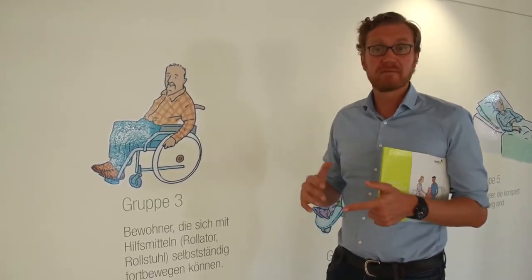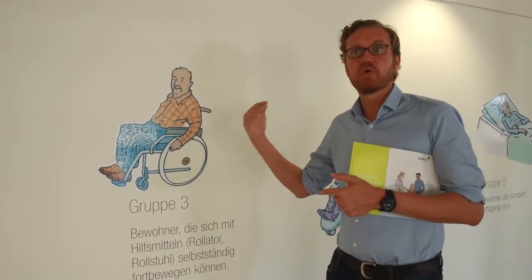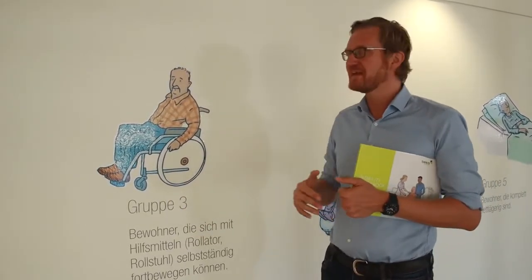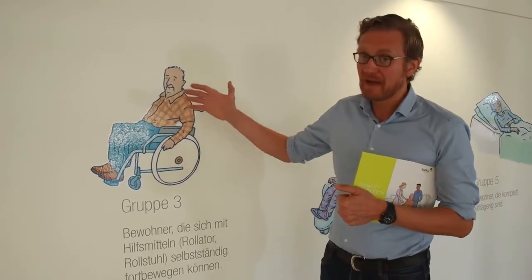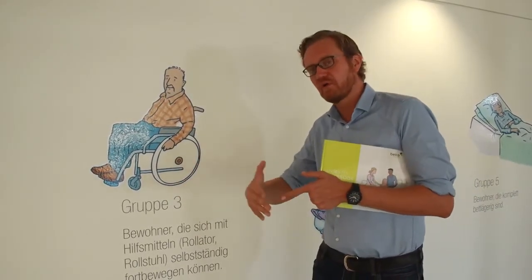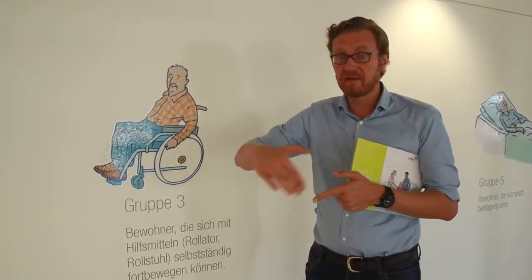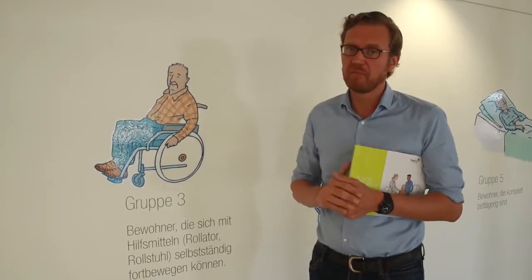And for the bathtubs, for example, or the hygiene, he needs a shower chair, he needs a Motion bathtub. He can maybe get up and sit in the Motion bathtub, but the way he has to go there, he needs, for example, a NORA, or he can go with his wheelchair and then do the transfer to the Motion.